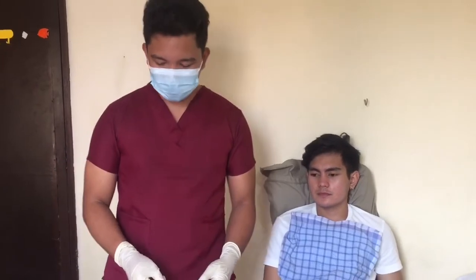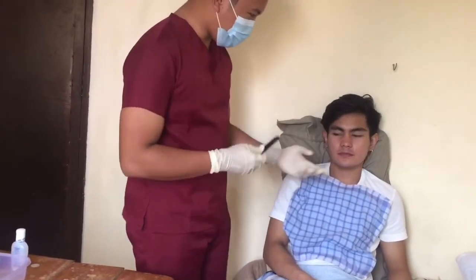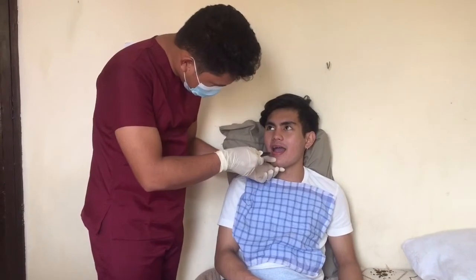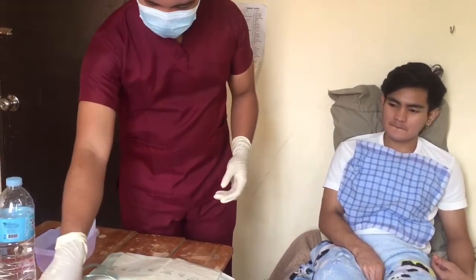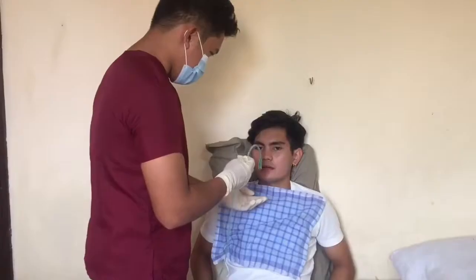The next is the oropharyngeal suction. Pull the tongue forward if necessary using gauze. Insert the catheter using the dominant hand. Advance the catheter about 10 to 15 centimeters.